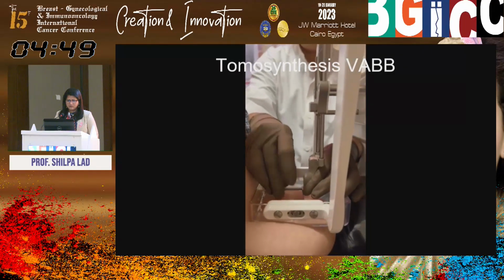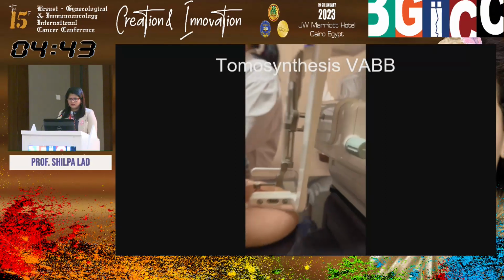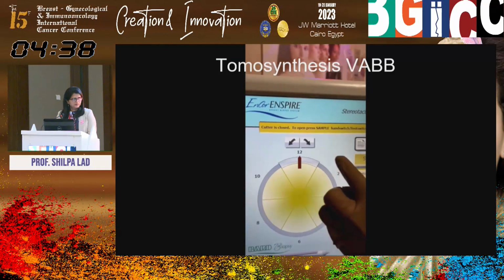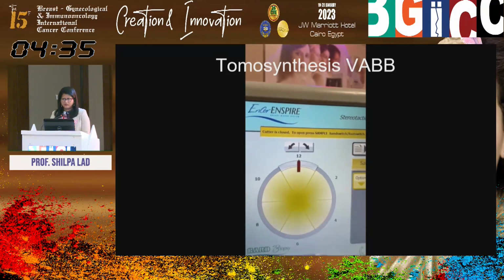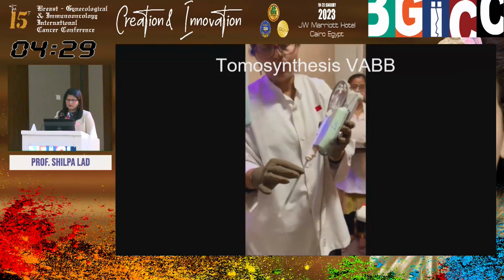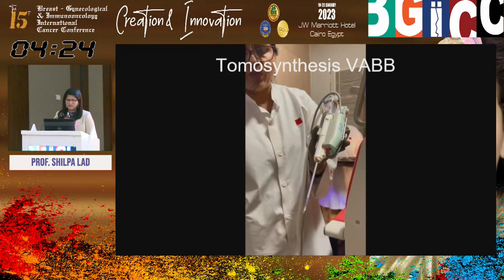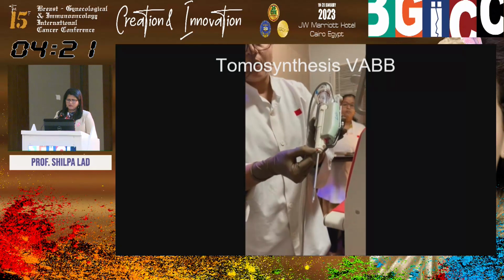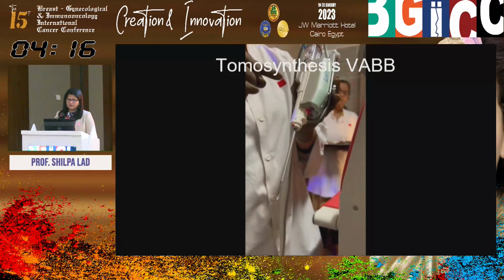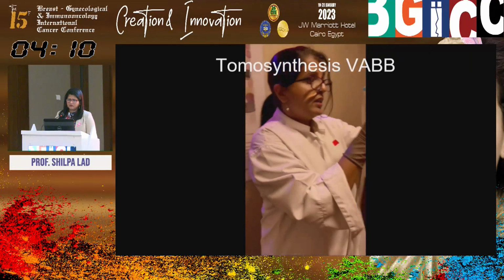The guide is back in place, and now with the vacuum biopsy, we are going to select on the screen here the complete 360 degree, okay, so that once the needle is in, it goes all the way around. We will load the vacuum needle. So the vacuum needle has this part. This is the opening from where it is going to obtain its samples, and this is the spot. This red marking shows exactly where it is going to obtain the sample while it rotates through the 360 degrees. We're going to mount this on the machine here.